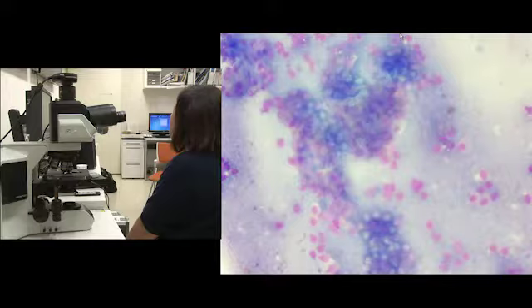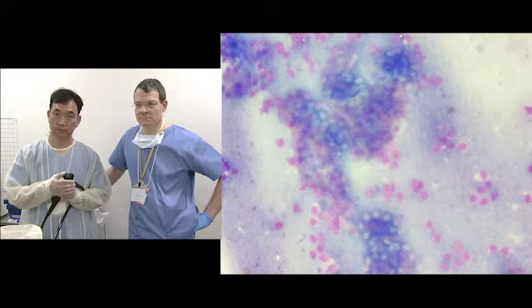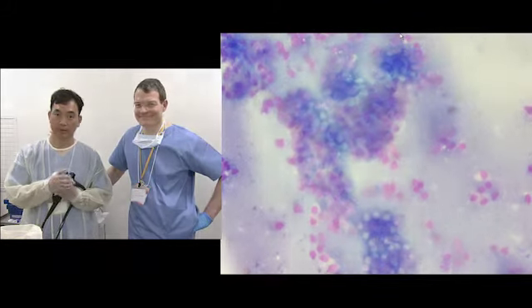How many passes did you do? I just did one. Okay. On the glass, it looks like there's a fairly good amount of core tissue. Okay. Thank you very much. Thank you for your question.